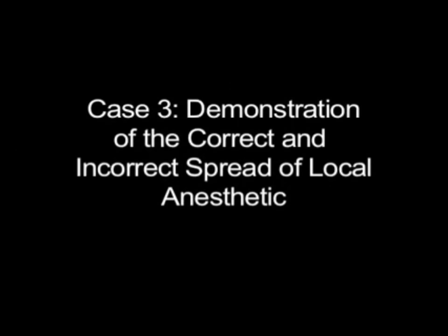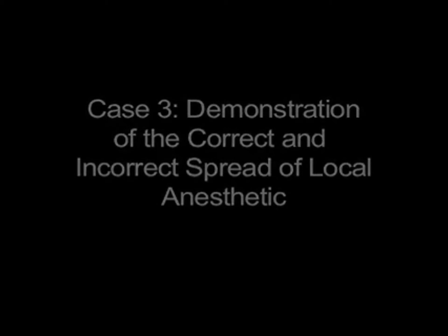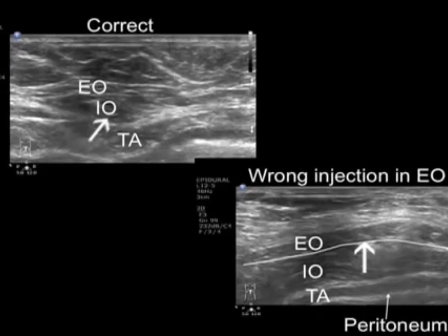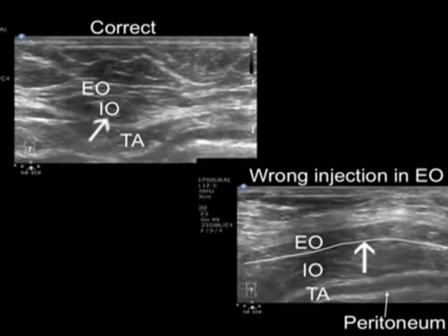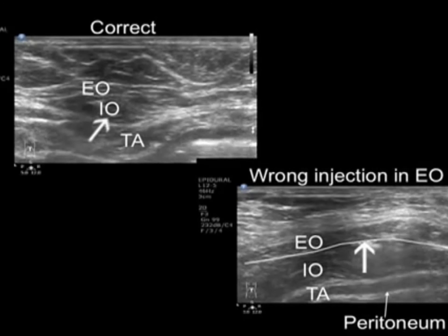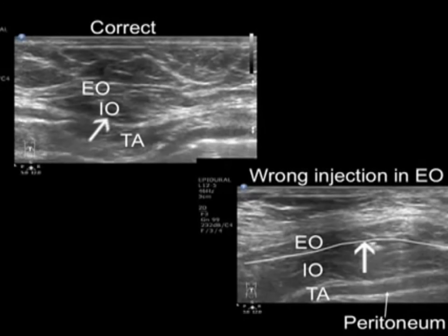Case 3 demonstrates both the correct and the incorrect spread of local anesthetic. The correct image is seen on screen left and the incorrect on screen right.